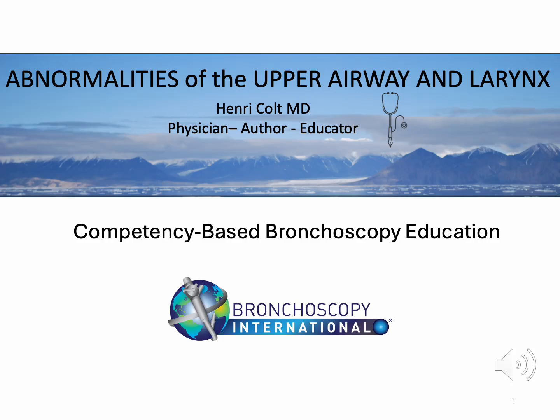I am Dr. Henri Colt, and this presentation is part of Bronchoscopy Academy, an ongoing competency-based curriculum in flexible bronchoscopy. The goal of this work is to improve procedural understanding, anatomical recognition, and clinical judgment while helping reduce patient suffering associated with unequal expertise and inconsistent training. In this lecture, we will review abnormalities of the upper airway and larynx.